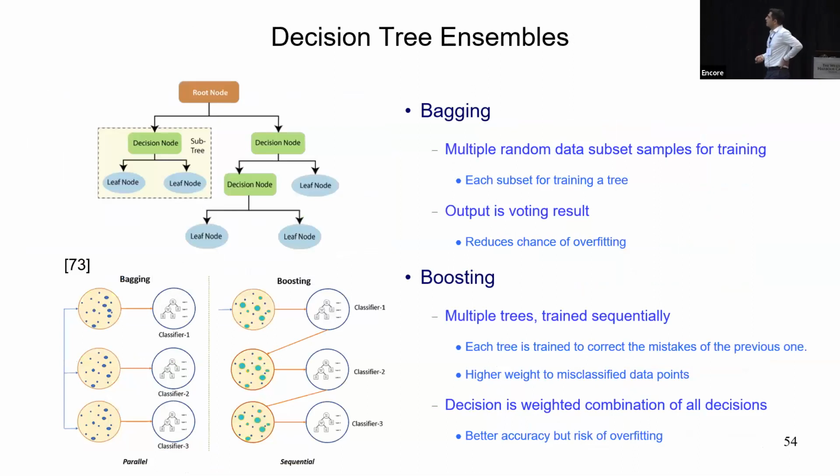Okay. Another category of classifiers that people have used for seizure detection are decision trees. The idea of a decision tree is actually quite simple. You start from a node and you start answering some yes/no questions until you get to a decision. With shallow decision trees, it's very hard to perform a good job with seizure detection.